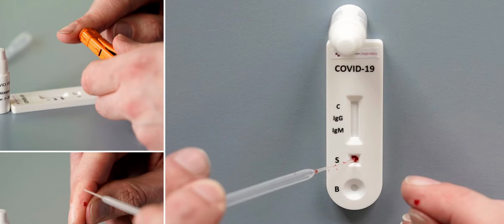For that we need the rapid test kit, your blood sample, and a buffer solution, which will be provided with the kit itself.